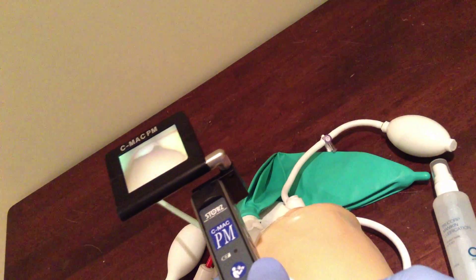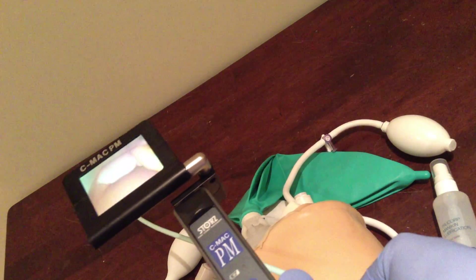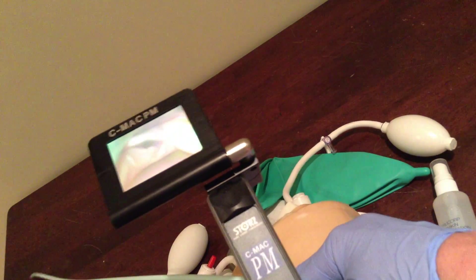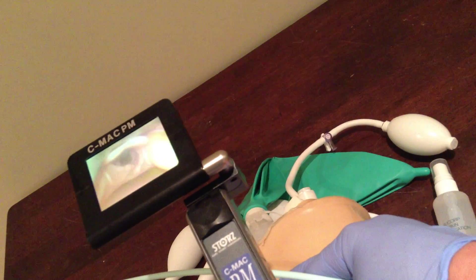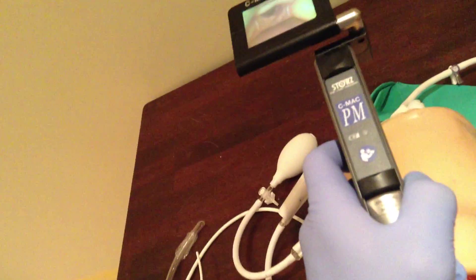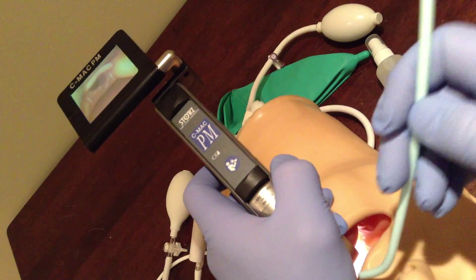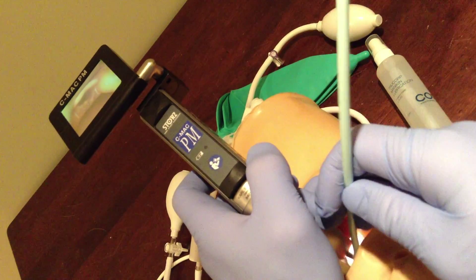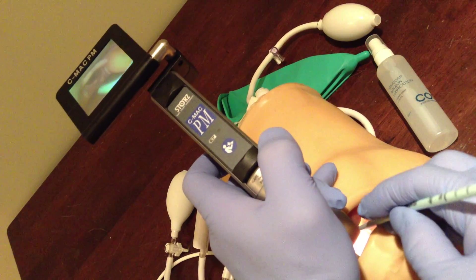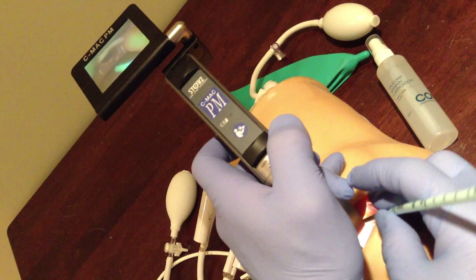So you can see the tip of the epiglottis there. Move into the vallecula, get right in there. Try to get in and engage the hyoepiglottic ligament. A bit of external laryngeal manipulation and I'll get a good view. Okay, it's pretty hyper-angulated. What I'm going to do is try to follow the curve of the blade and see if I can get this up there. And I just can't quite get the bougie to negotiate that curve, because it's hyper-angulated.